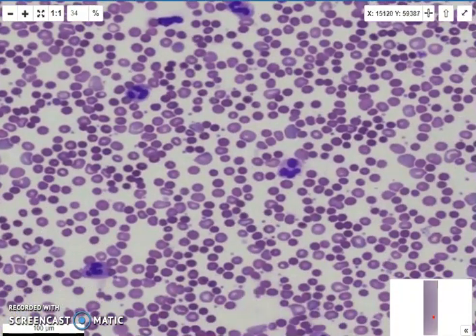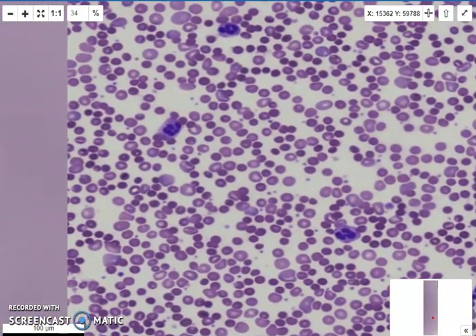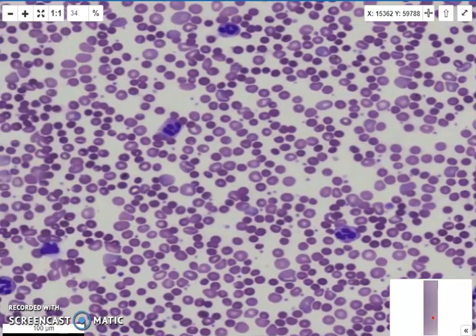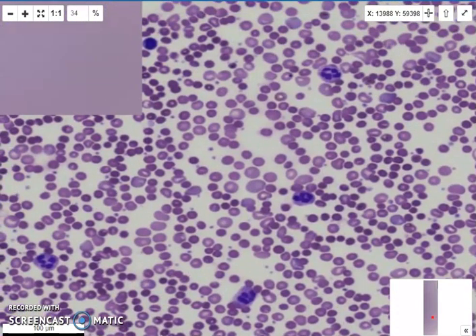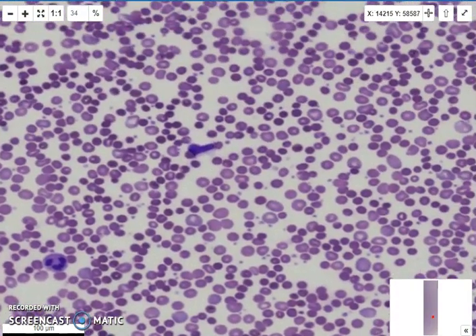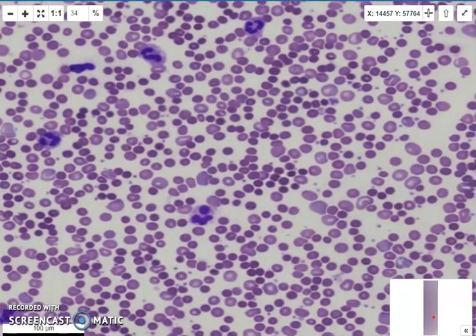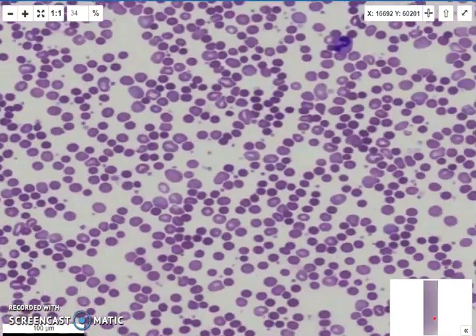But again, the spherocytes look pretty much the same, perfectly round, dense color, which makes it look like a dimorphic picture, but it really is just spherocytes versus reticulocytes. Pretty much any cell that is not a reticulocyte is a spherocyte. And so eventually those reticulocytes too will become spherocytes as they get coated in complement for immune destruction.